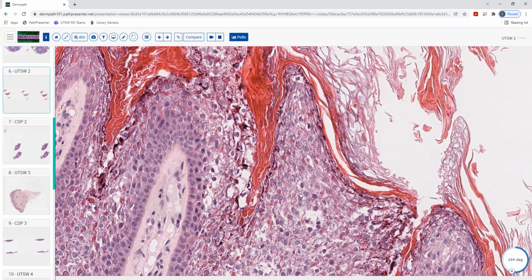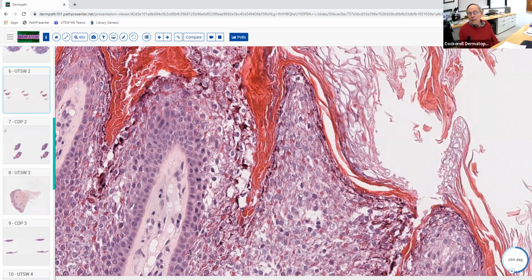I think you can see it in a palmoplantar keratoderma. Yeah, good. The so-called Unna-Thost type of keratoderma. You biopsy that, and it shows this kind of change. A lot of times those keratodermas can all look similar clinically, and then you biopsy them, and you don't really know what the epidermal reaction pattern is going to be.